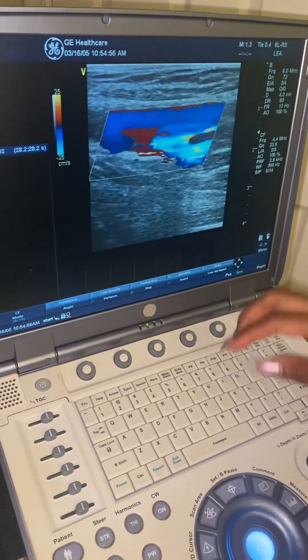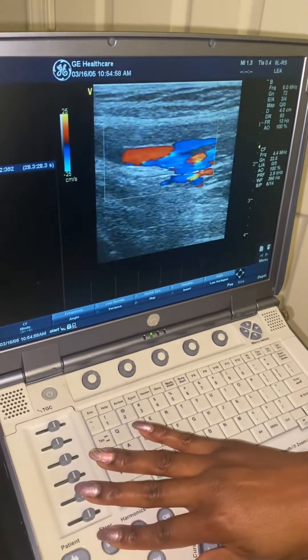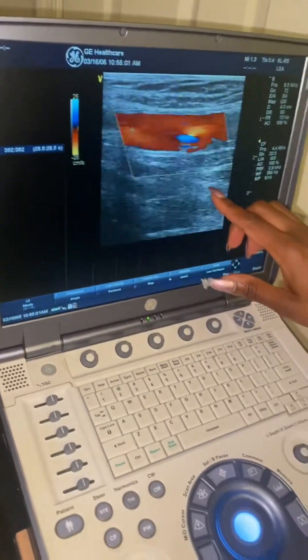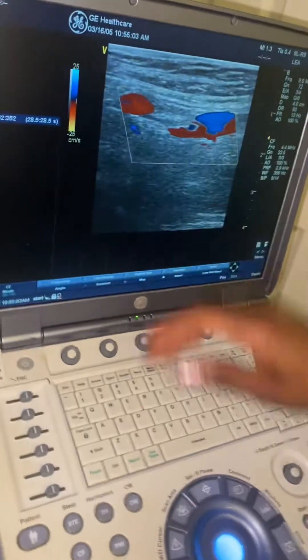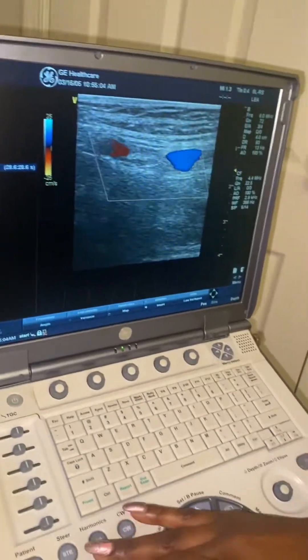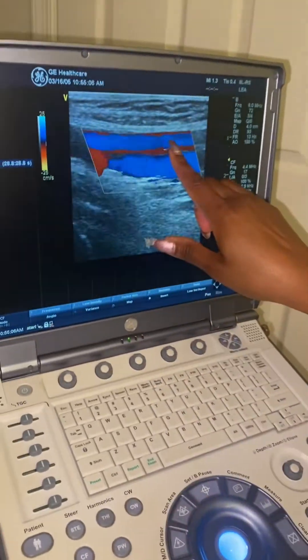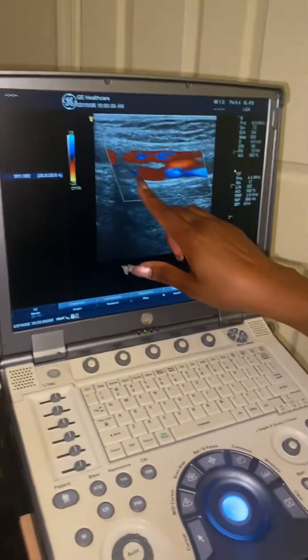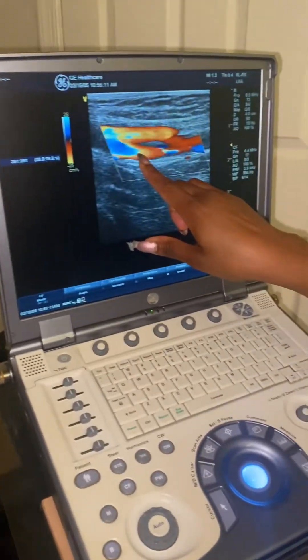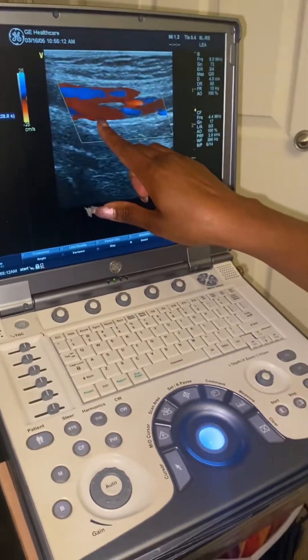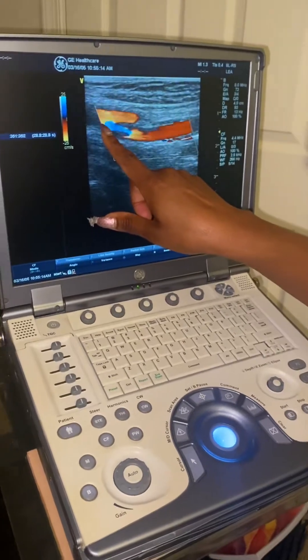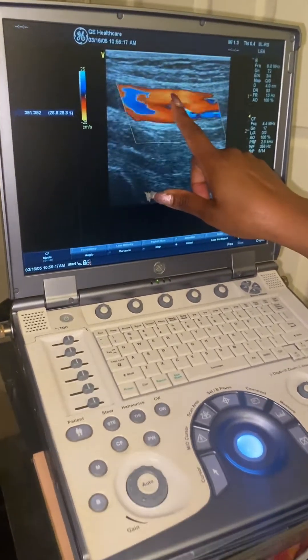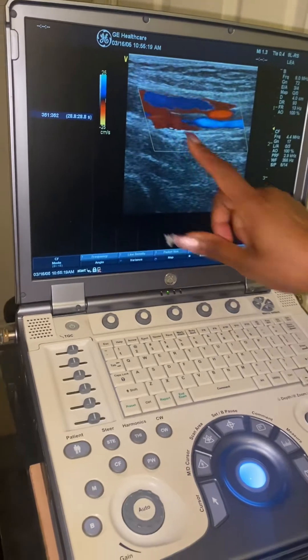I'm going to steer my box the other way so now I can get my deep femoral artery. You can see in this view I'm squeezing that vein out of the way. You can see the femoral artery and the profunda right there — you can see your bifurcation. So you want to get a waveform at the common femoral, the femoral, and at the profunda artery.